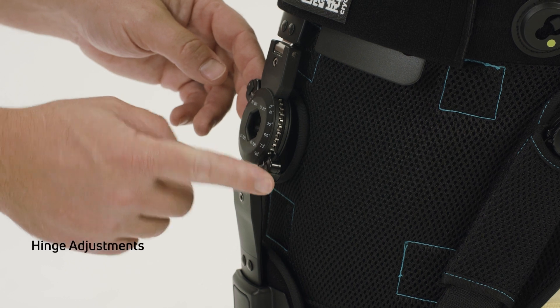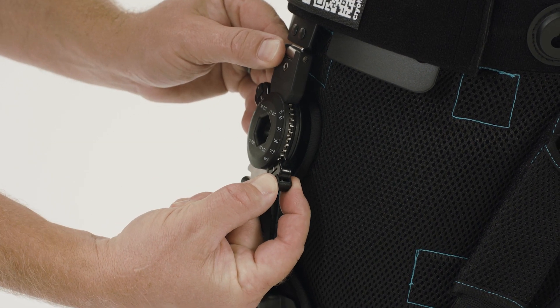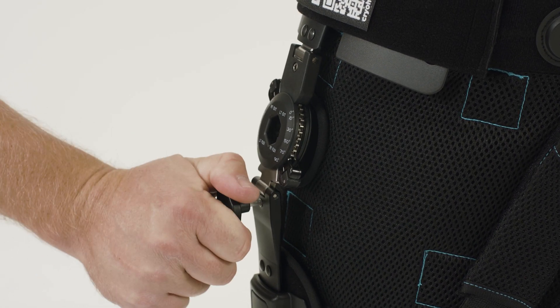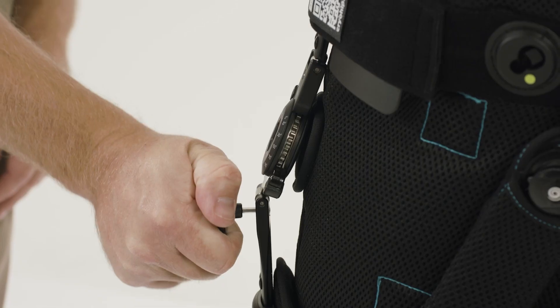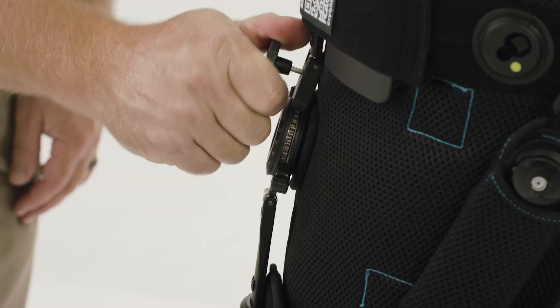Flexion and extension can easily be adjusted by pulling the locks outward. The hinge permits abduction above and below the hinge. Use the included adjustment tool to adjust the pivot points above and below the hinge. Be careful not to over-adjust the abduction points, as the plane of the hinge will adjust as well.